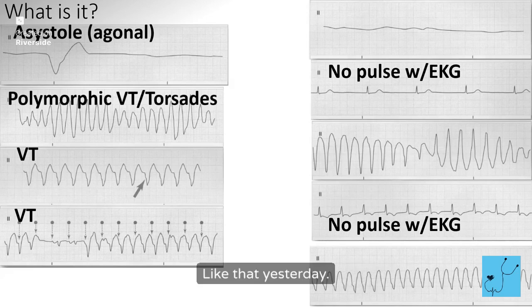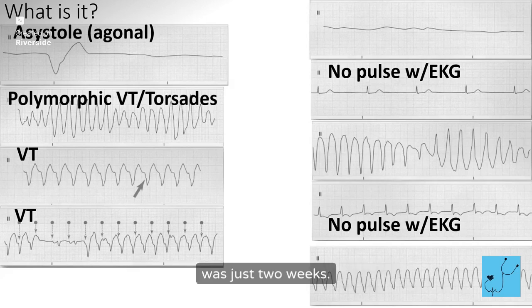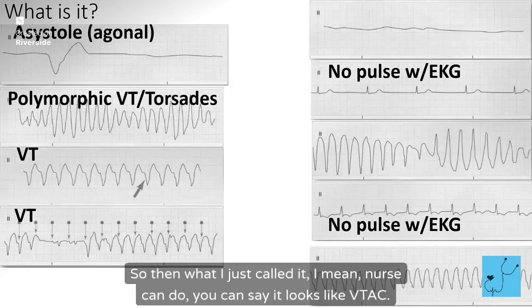Like that yesterday. Well, when I called the nurse, it was like that too. It was just like two peas. She told me that she saw some P's in here, just like that. This part. So then when I just called it, like change in rhythm, heart rate is this. I mean, you can say it looks like VTAC.